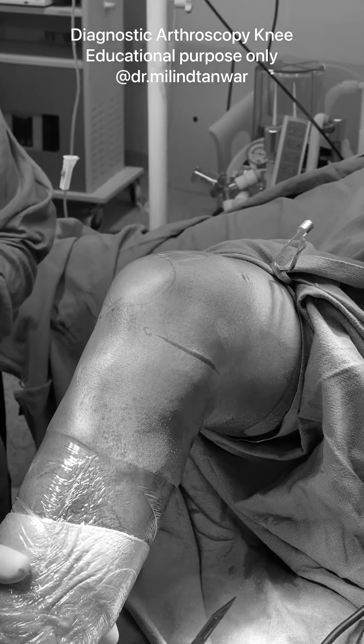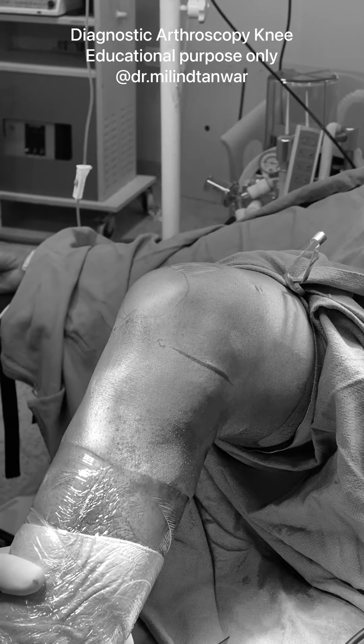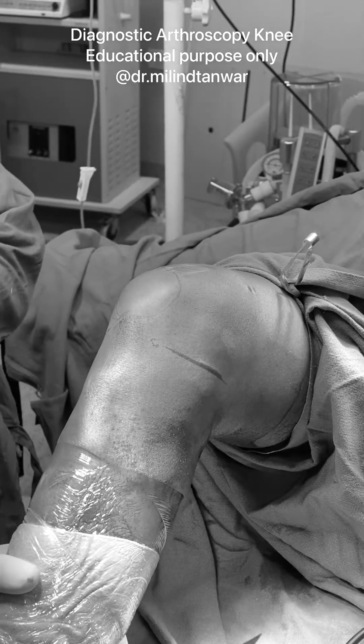This is a diagnostic arthroscopy case where there is a loose body complaint. The patient has been having a loose body sensation for a long time.